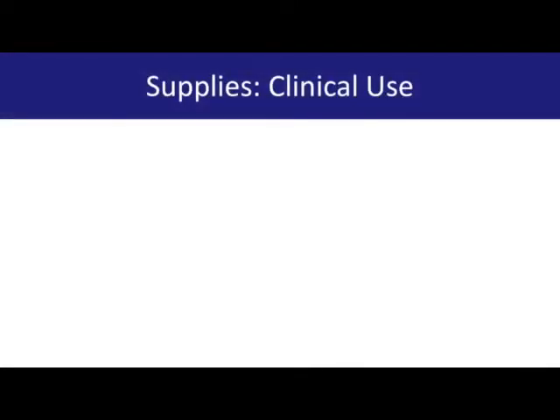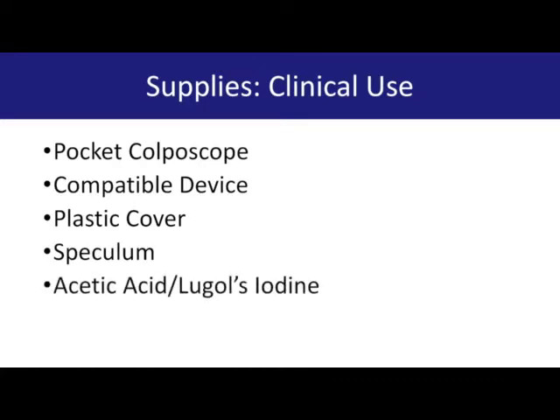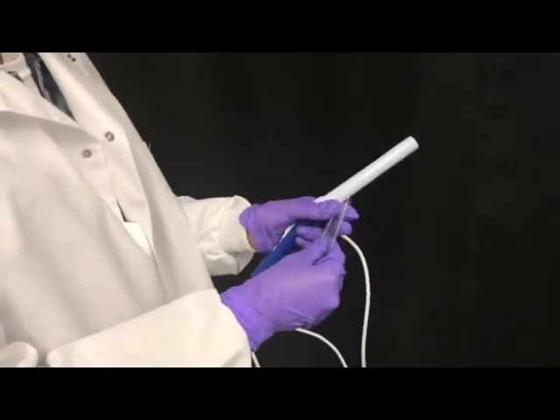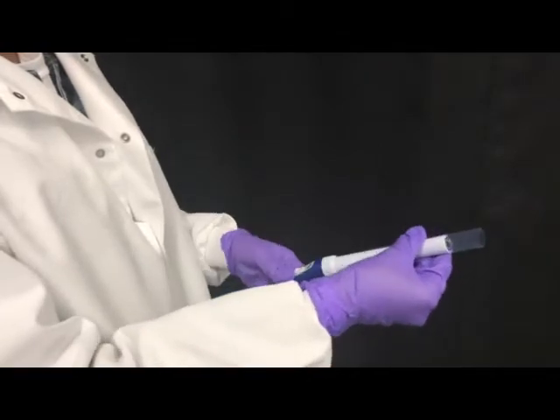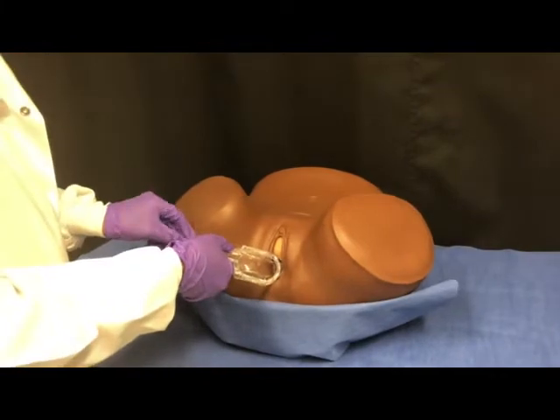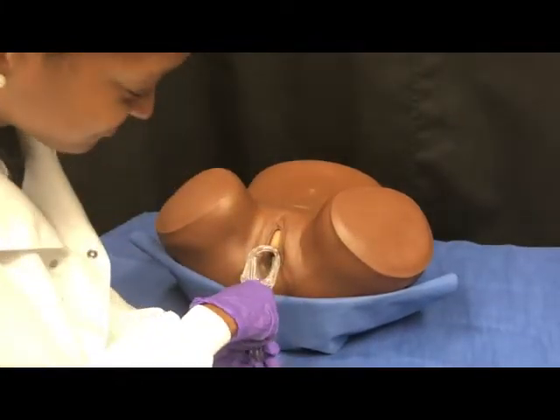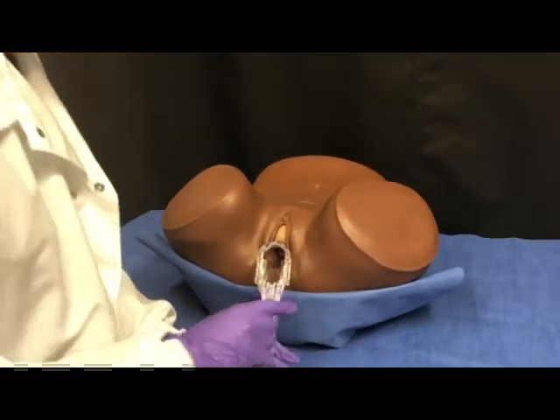To perform an exam, you will need the pocket colposcope and a compatible device. A plastic cover to put over the probe is optional, but in many cases used. Then, as in a regular exam, the speculum, acetic acid, and Lugol's iodine will also be used. Place a clear plastic cover over the pocket colposcope to reduce contamination during the procedure. Following proper clinical protocol, prepare the patient. When used for examination of the cervix, the pocket colposcope should be used with a standard vaginal speculum.